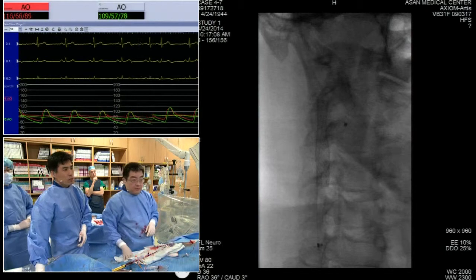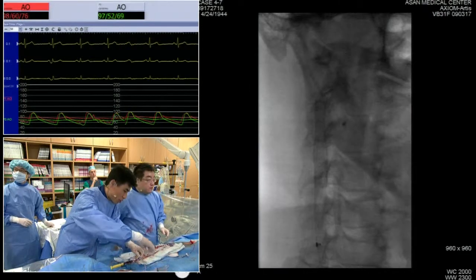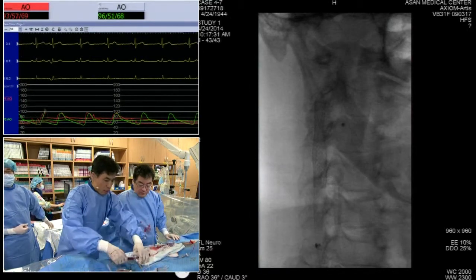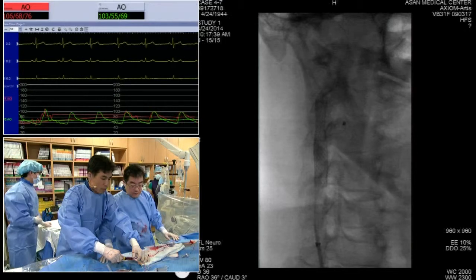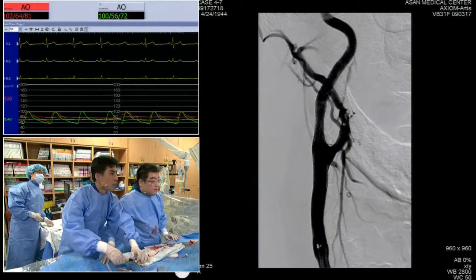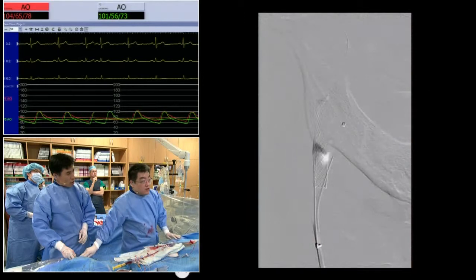Total occlusion time is about 5 minutes. Yeah, 5 minutes to be exact. Okay, I will remove the contrast. So we're ready to take the final shot here. Contrast already removed here. Okay, angiogram. Ready? Ready. Okay. That looks nice to me. Let's take an intracranial shot.